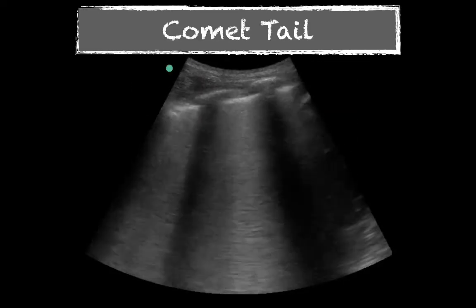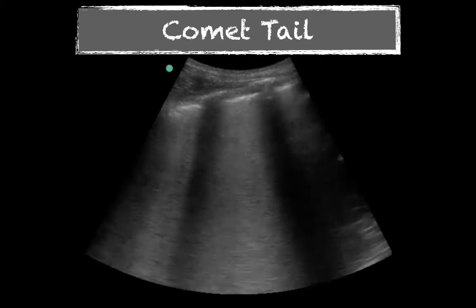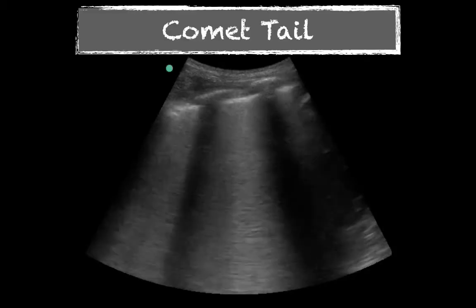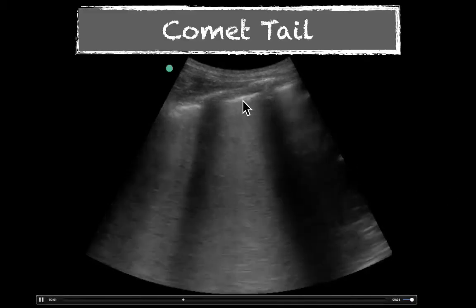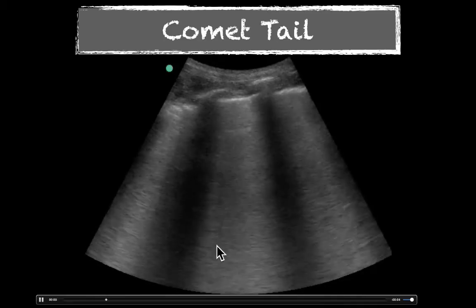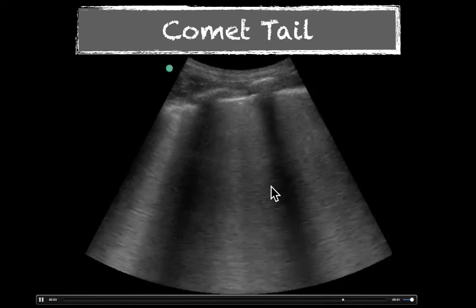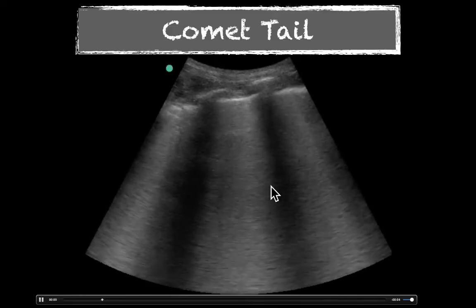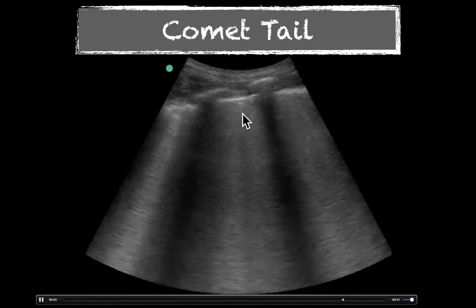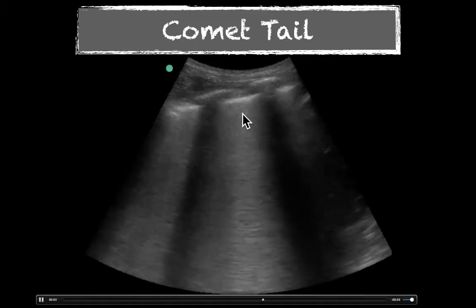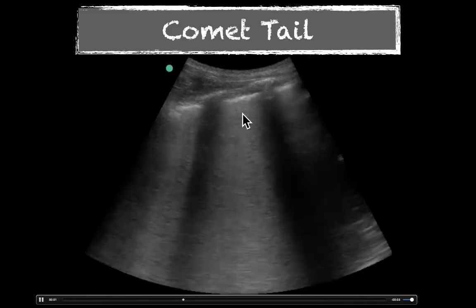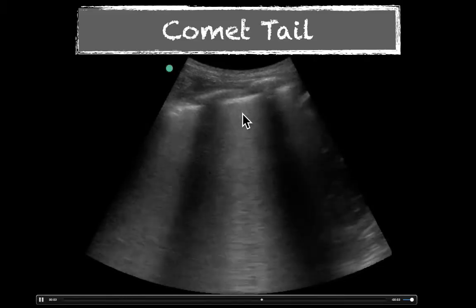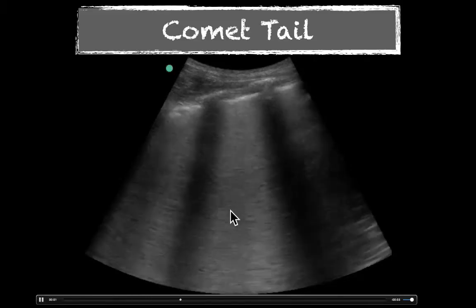A comet tail artifact is similar to reverberation artifact. In most cases it's going to bounce between an air-fluid interface, and it's not usually a foreign body. On this lung ultrasound, we see a bunch of structures up here that comet tail off — people also call these lung rockets. You can see that in the bowel when there's a strong air-water interface. Essentially it's that same ping-pong philosophy bouncing back and forth between air sacs and water, until some of that sound wave amplitude makes it back to the machine and creates this structure.